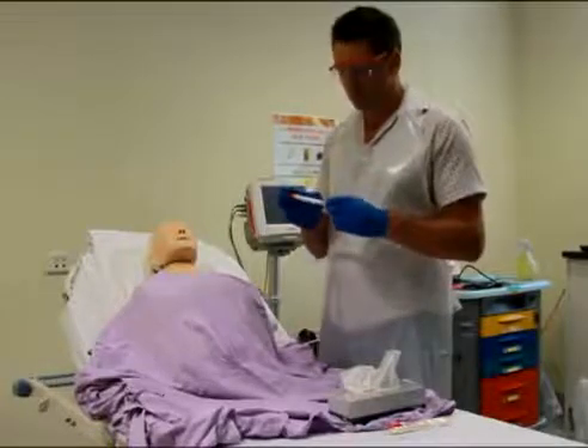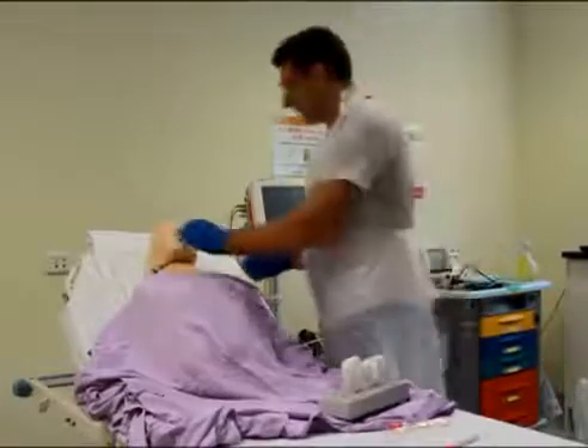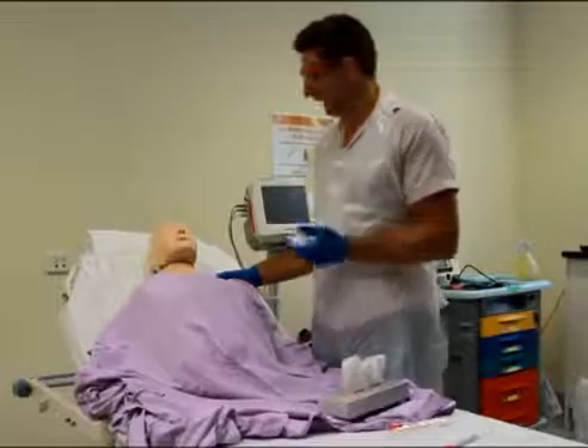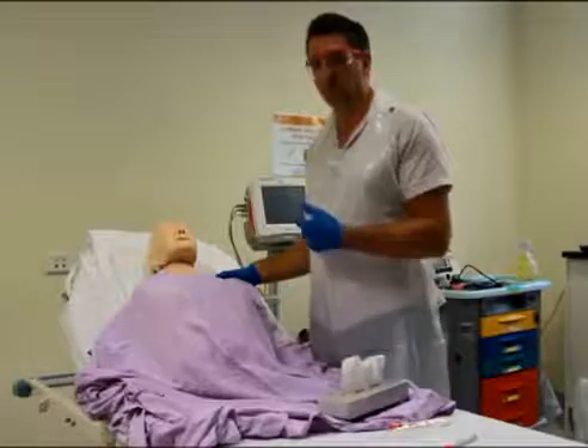Quickly put the specimen into a container. Give Roger a tissue so he can help blow his nose, make sure he's comfortable after the procedure — his eyes will be a bit watery. If you're doing it on a child, they'll get quite miserable so they'll probably want to cuddle with mum and dad.